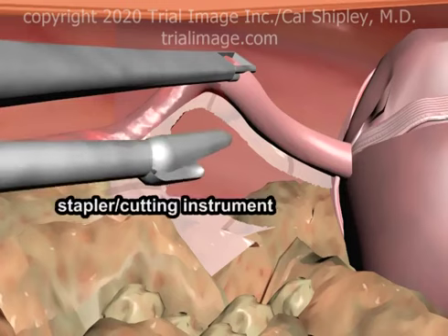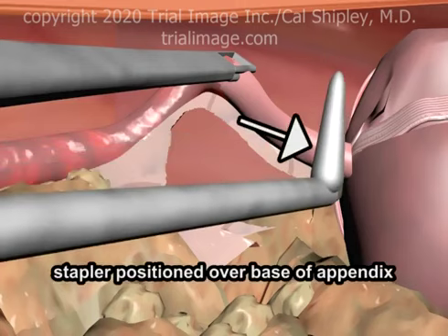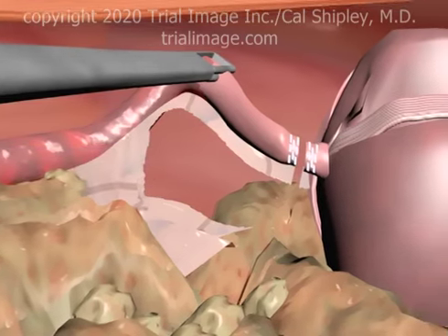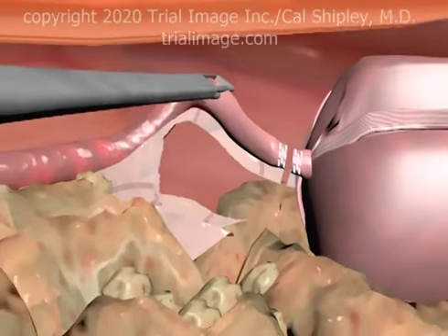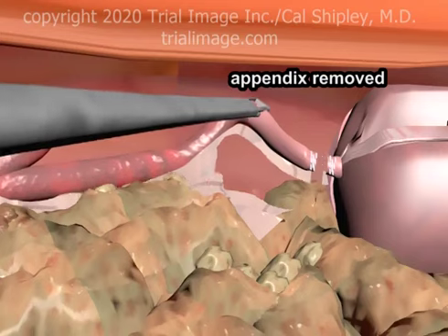A surgical stapler is positioned over the appendiceal base, and with one action, it severs the base from the cecum, and also staples and seals both sides of the incision. The remaining appendiceal stump is about 5 millimeters in length. The infected appendix is now free of all attachments and may be removed.